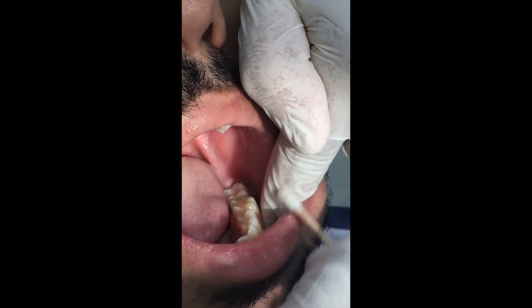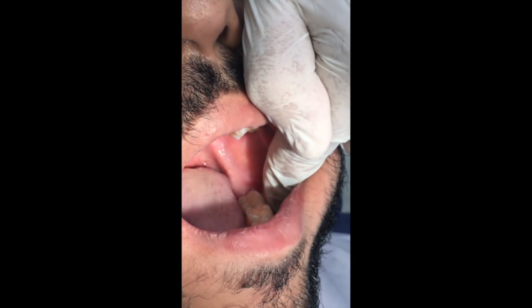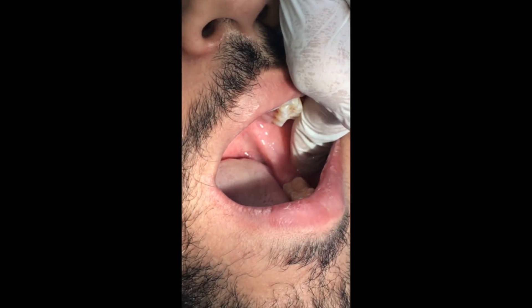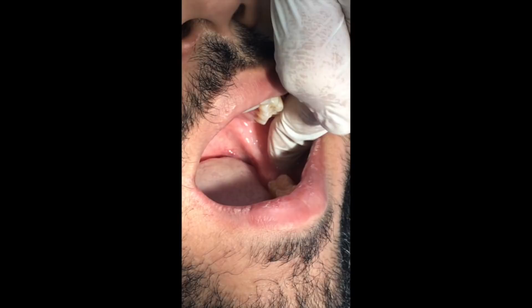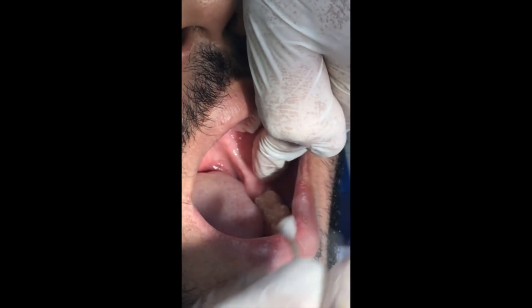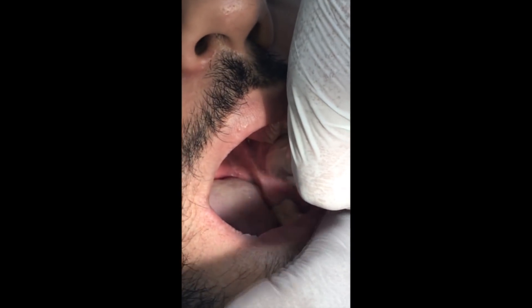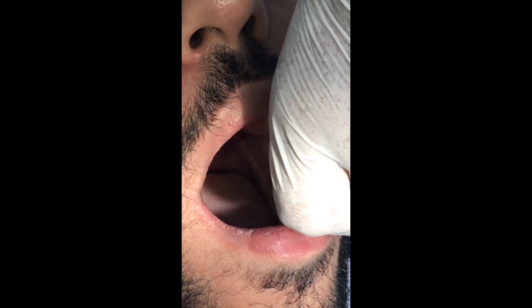Left side demonstration: I place my index finger vertically and proceed posteriorly until I feel the external oblique ridge. Then I trace it posteriorly and superiorly. At this point, I find that the external oblique ridge tries to displace my finger laterally. So you should feel the external oblique ridge with the most lateral area of your index finger, and continue tracing it. Your finger should be medially placed while the external oblique ridge is felt on the most lateral area of your finger, until you find the most concave area.